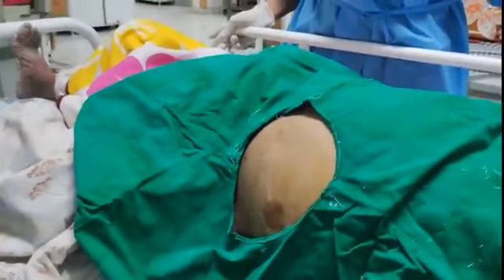Once you have anesthetized the area properly, proceed further. Apply pressure on the anesthetized area and rub it until it dissolves. Please follow all aseptic precautions.